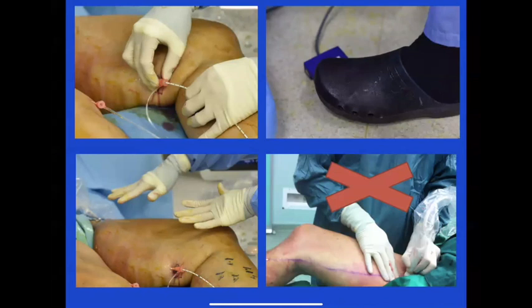So you use a pedal and the pullback, and you do not need to compress the vein down onto the probe. And that's the beauty of this, because you can just put no pressure. You do not even need to put the head down to do this, like you have to do with RFA and laser.